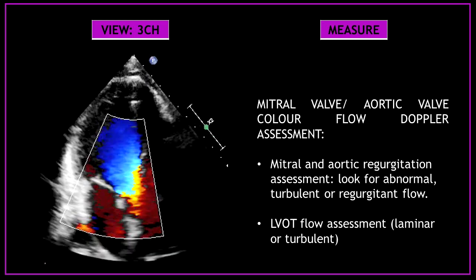To finalize, use color Doppler to assess the blood flow across the mitral valve and aortic valve. As part of the mitral and aortic regurgitation assessment, look for abnormal, turbulent, or regurgitant flow. Also assess the flow across the left ventricular outflow tract and look for laminar or turbulent flow.